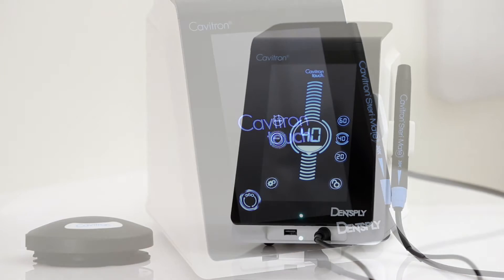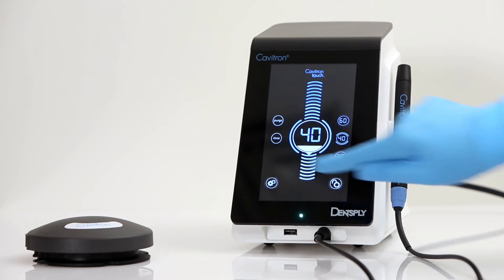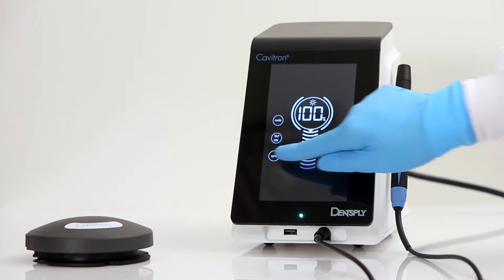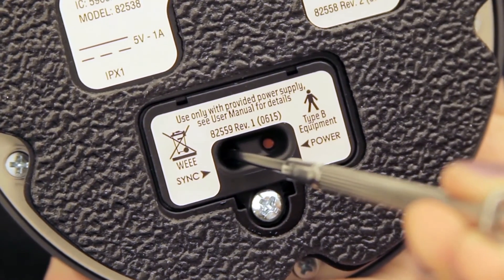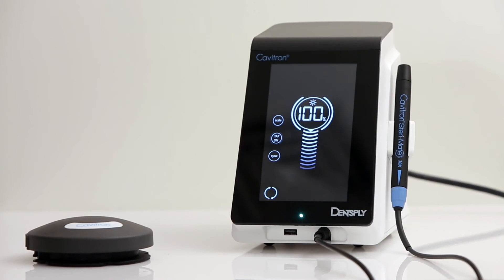The main screen will appear, also referred to as the scale screen. Please remove any inserts from the handpiece. Next, press and hold the settings icon until the settings screen appears. Press the sync icon on the settings screen, followed by pressing the red sync button on the bottom of the foot pedal and hold for at least 3 seconds. Synchronizing is complete once the sync icon has stopped rotating and a sound indication occurs.